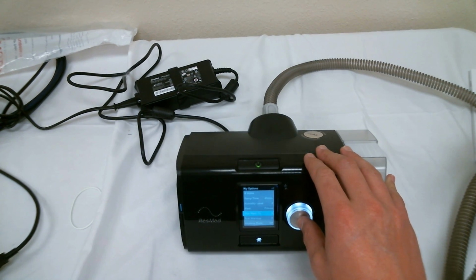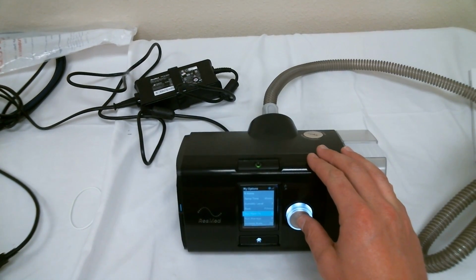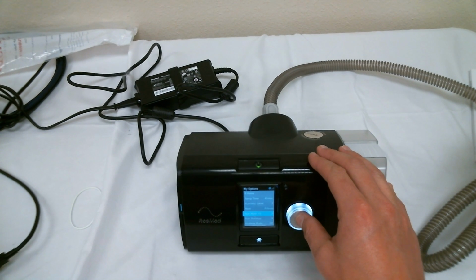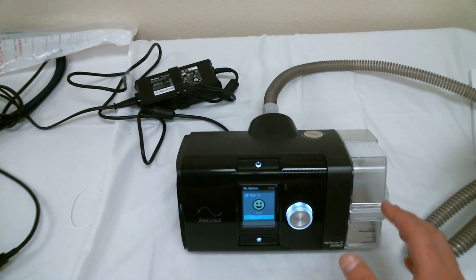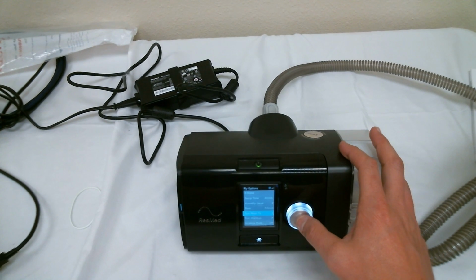The next option is your Run Mask Fit. This option allows you to detect whether or not you've got a good mask fit after assembly and upon use. By pressing it, it will start to pressurize the mask and will tell you whether or not you have a good fit by showing you a happy face for a good fit and a frowny face for a bad fit. Once you've adjusted to get it correct, it should return to a happy face. Press again to stop the mask fit.